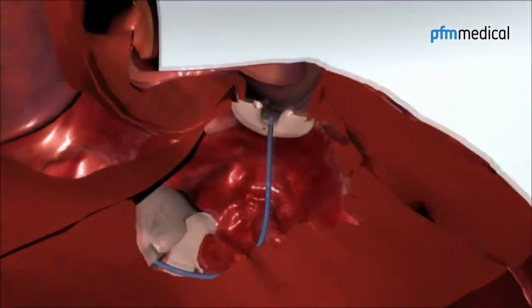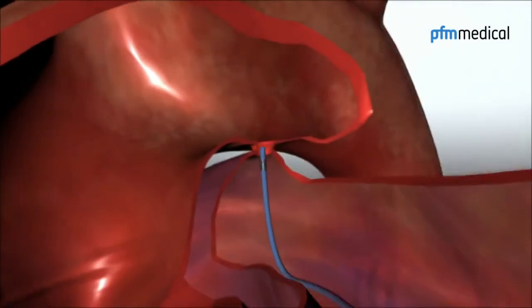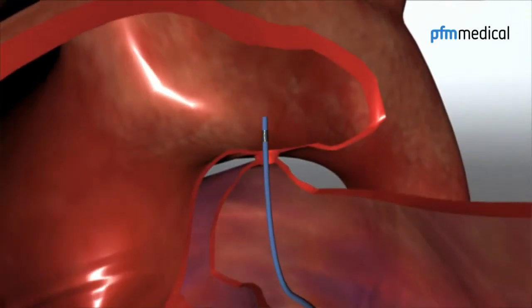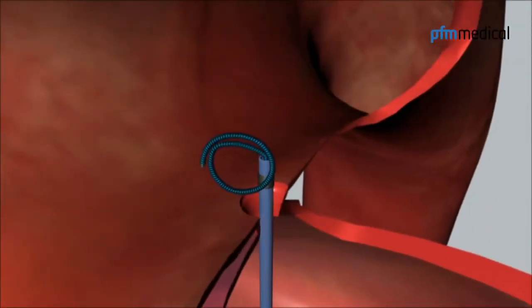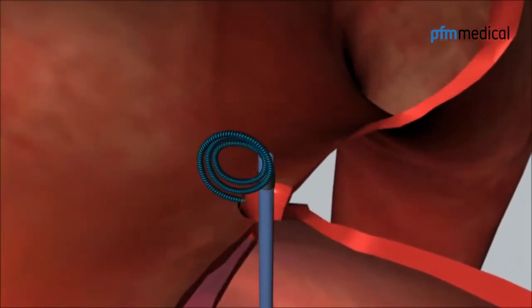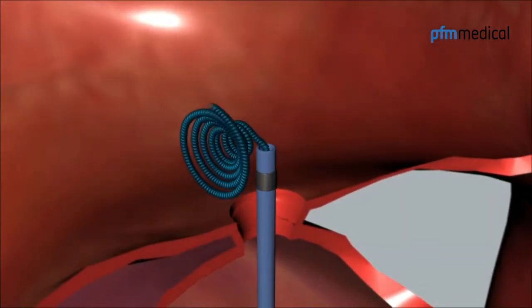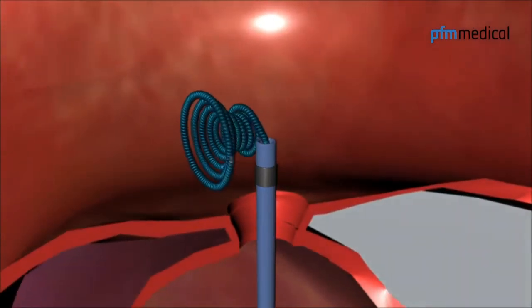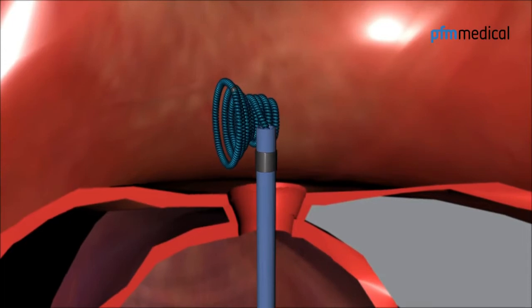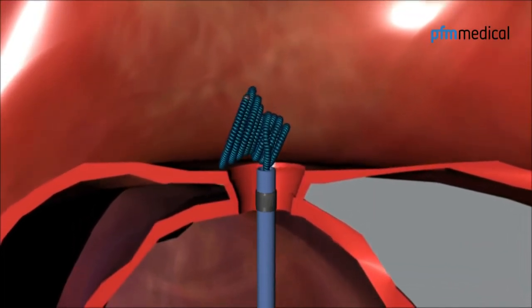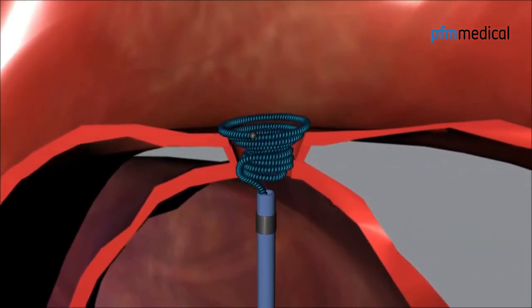The implantation catheter is advanced from the pulmonary artery, through the defect and placed in the descending aorta. The coil is advanced to the distal end of the implantation sheath. All but one loop is configured outside the implantation catheter. The entire system is retracted until the configured coil is positioned in the ampulla of the ductus.